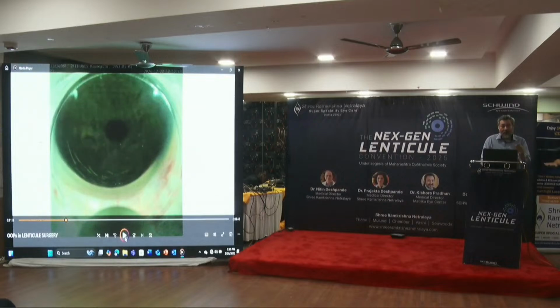So did you understand what I said? You can get a suction loss. People are talking about suction loss, but so what if it happened? It's not ruined, nothing. You can just do a PRK, it'll give you very good results. You can do a LASIK on it.